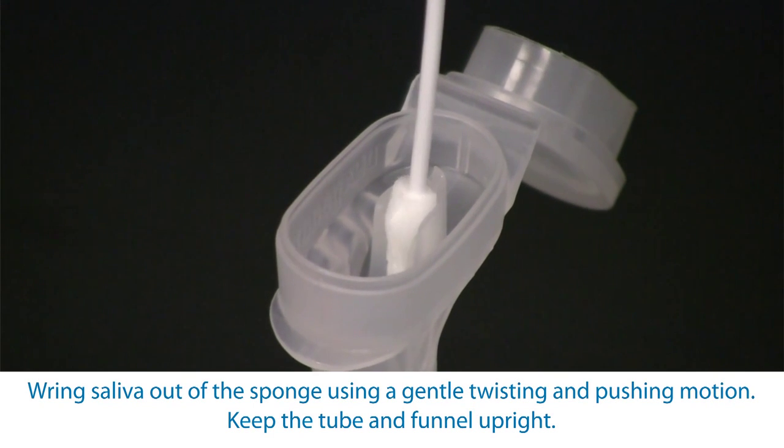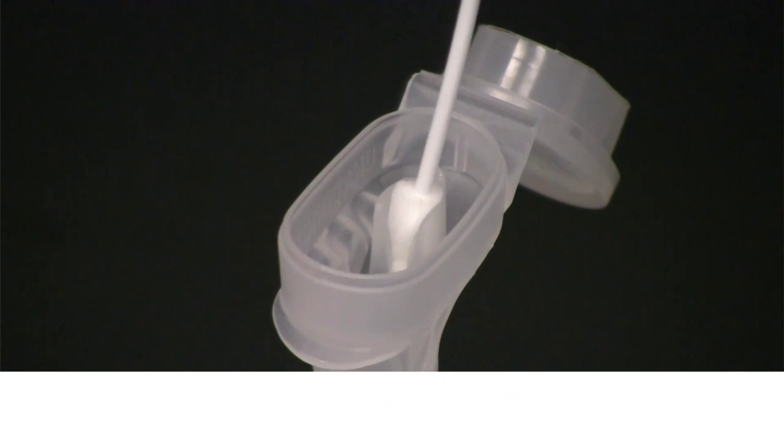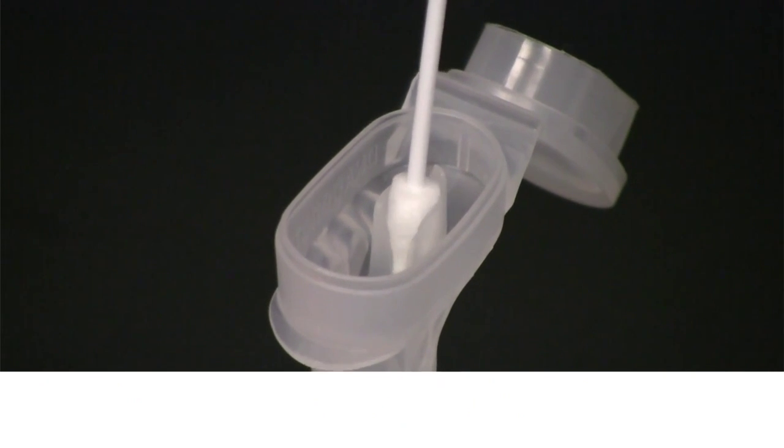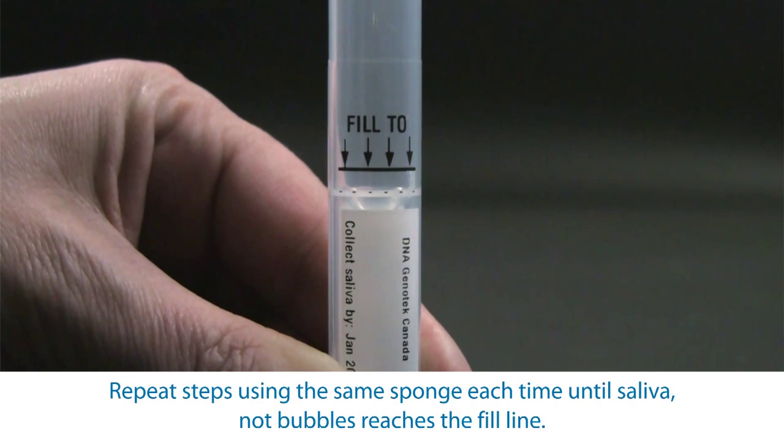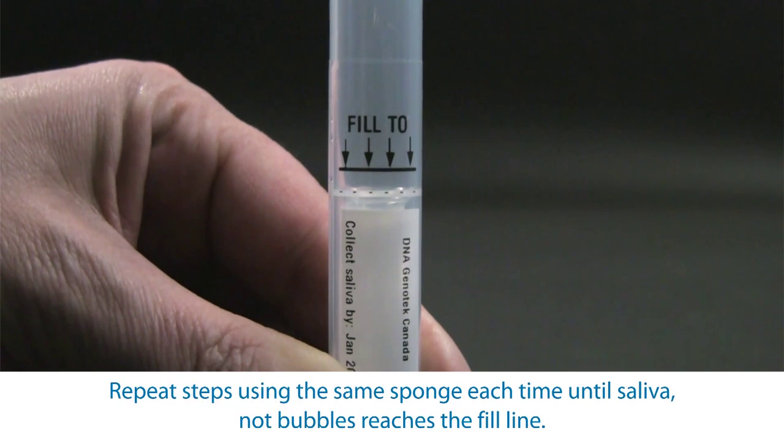Keep the tube and the funnel upright. You will see saliva flow into the tube, though it may take several passes within the mouth to obtain a noticeable amount of saliva.